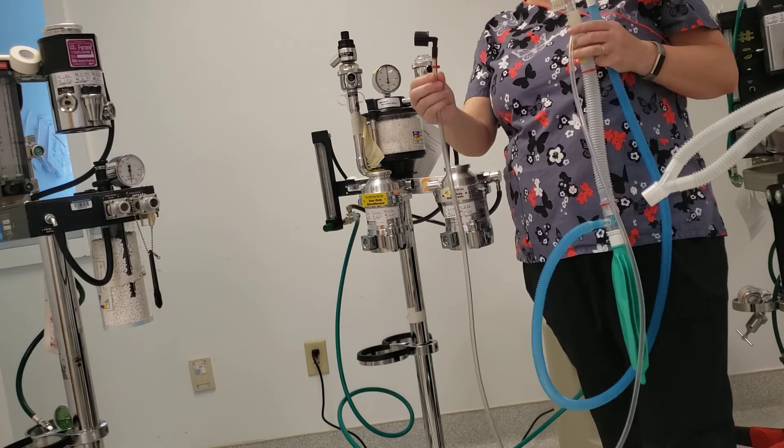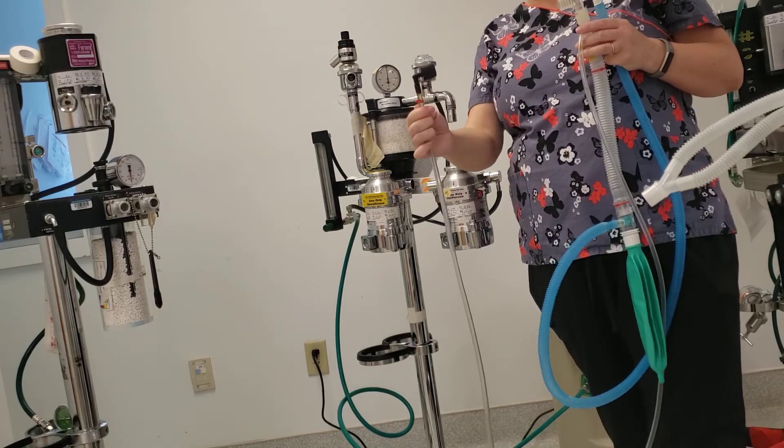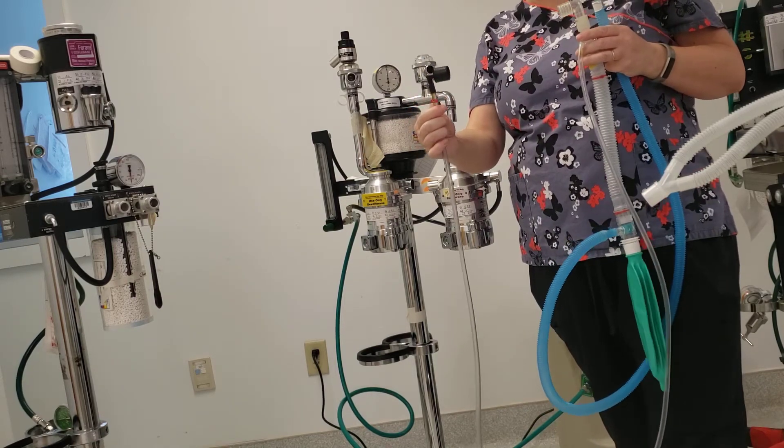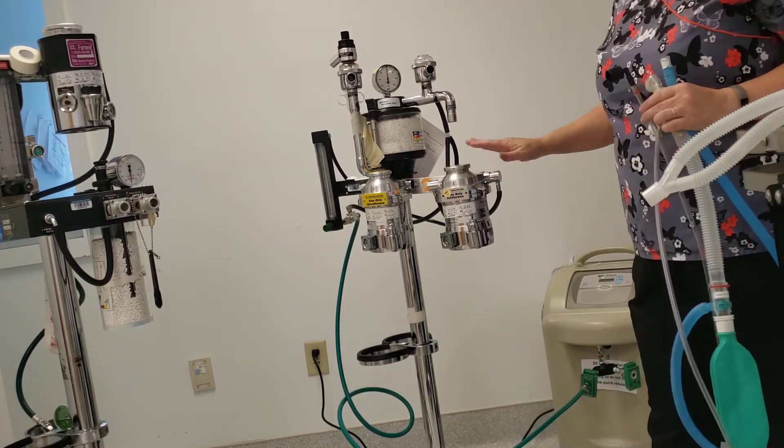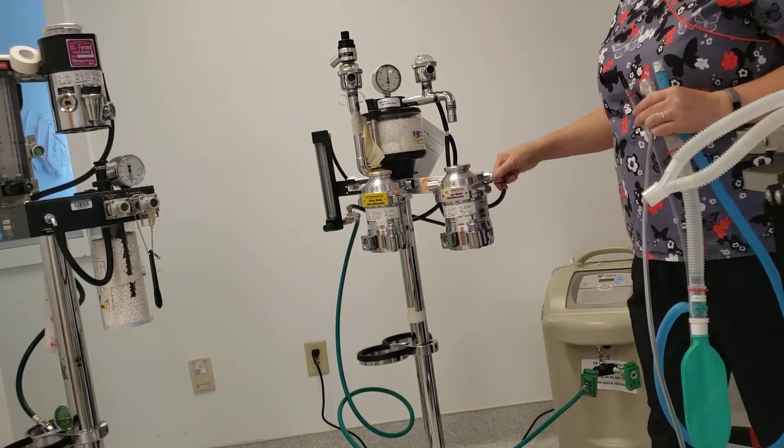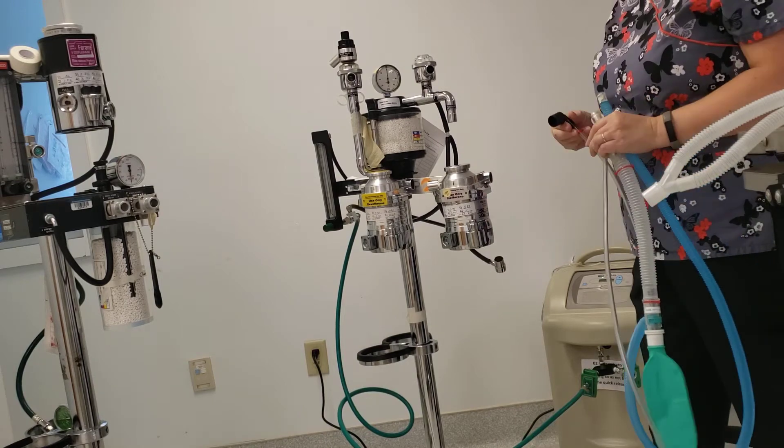All your non-rebreathers are going to have an end that looks something like this. Sometimes they're silver, sometimes they're black. This goes in the vaporizer outlet port — that's on the outside of your vaporizer.